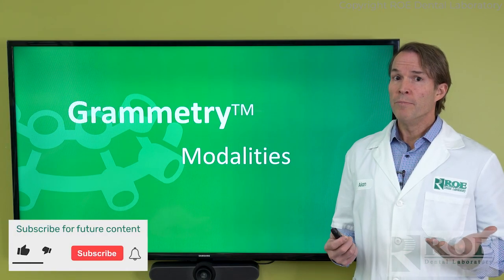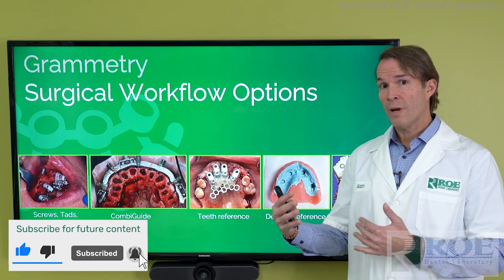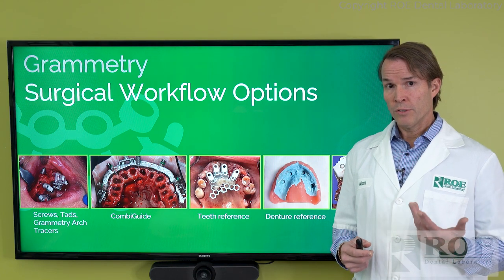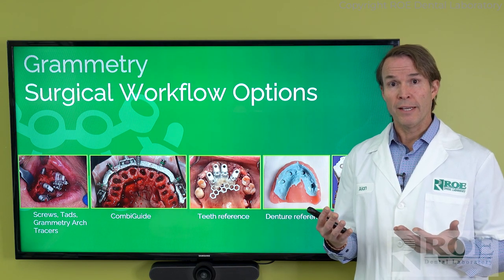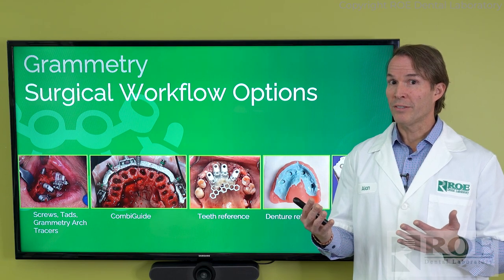Let's get into the modalities. The modalities are the different ways to integrate photogrammetry into the full arch surgical workflow. And we're going to talk about a few. The first one, which is screws and TADs, is the same type of process that you would use for photogrammetry. The same type, sort of. And I think you're going to like the twist.